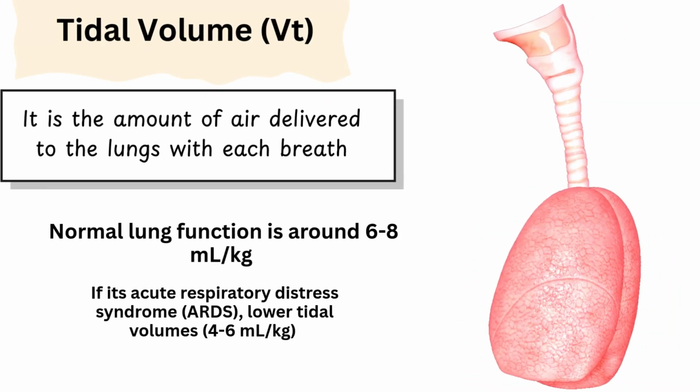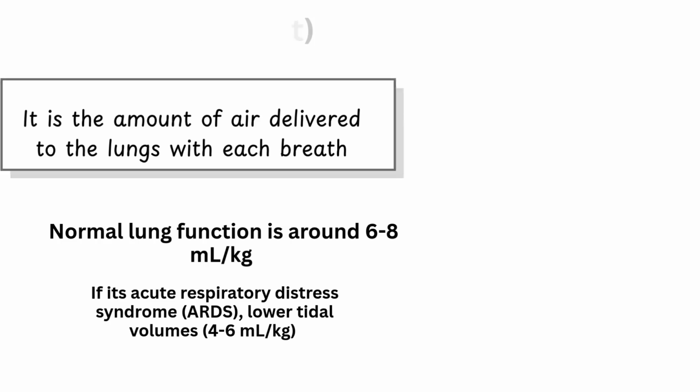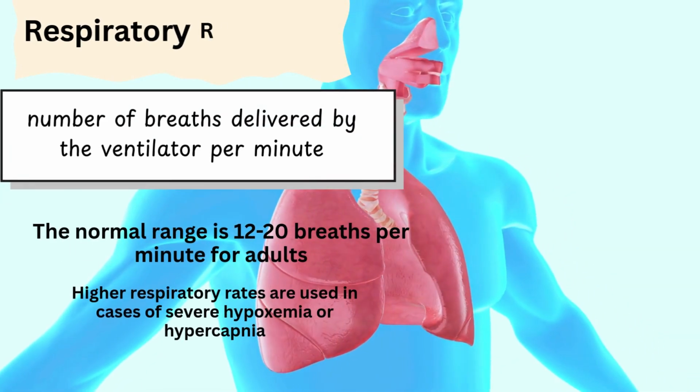Be mindful with proper tidal volume settings as it helps to ensure adequate ventilation while reducing the risk of barotrauma and volutrauma. Respiratory rate, RR.